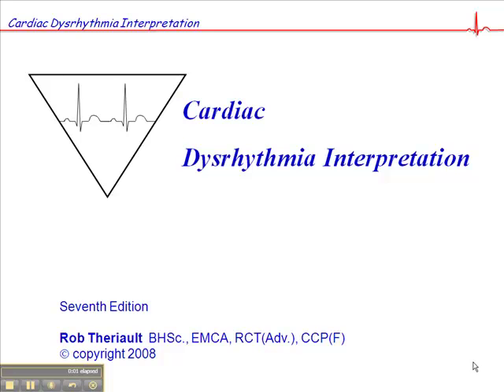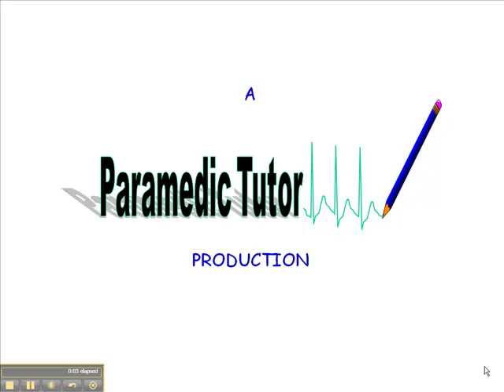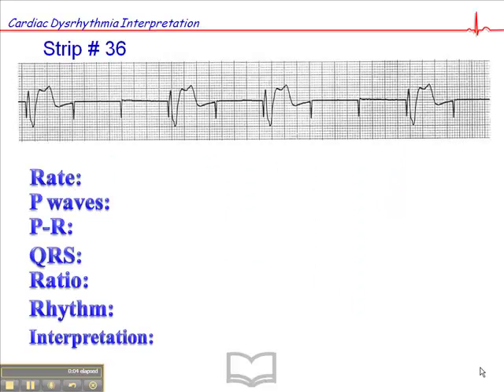Now we're on page 102, exercise 36, and this is a continuation from the last presentation. Again, we have a paced rhythm here where we have a problem — we have pacer spikes without QRSs. So let's start with the heart rate first.